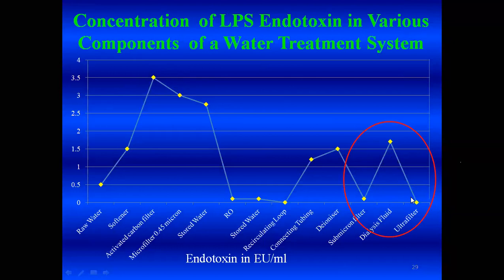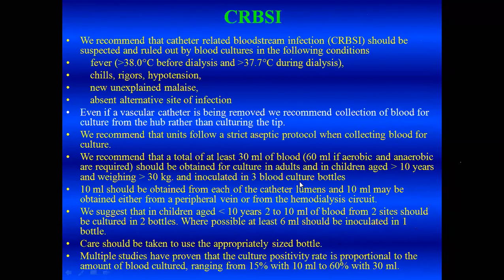If you are using a Fresenius or a Gambro machine which has an endotoxin filter built into the dialysate part, then that ultrafilter should take care of the endotoxin. But you need to make sure that the endotoxin filter is actually present, that it is working satisfactorily, and that the test that the machine should do, the cyclic pressure holding test, has not been bypassed.